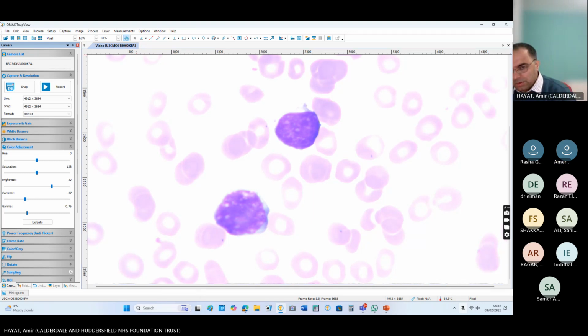So on the peripheral blood, we can only say whether this is leukemia or not. This patient has leukocytosis. Abnormality is in the white cell, so comment on the white cell first. Then go to red cell and platelet. Give your impression that this is likely acute leukemia, and give your suggestion that we need urgent peripheral blood flow cytometry for this patient.